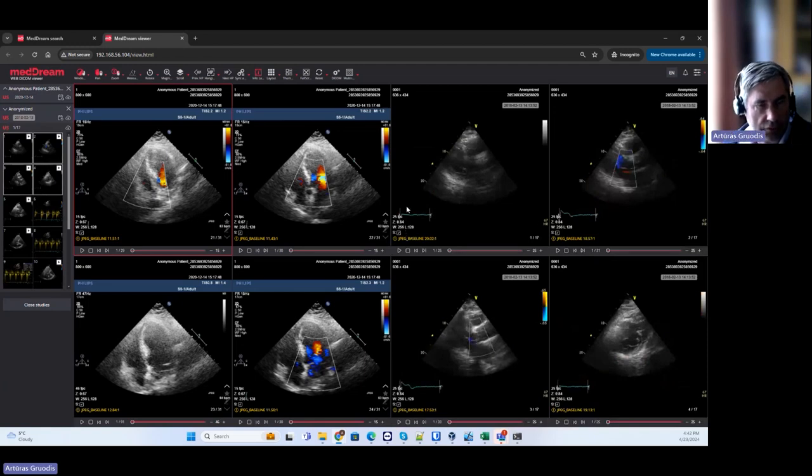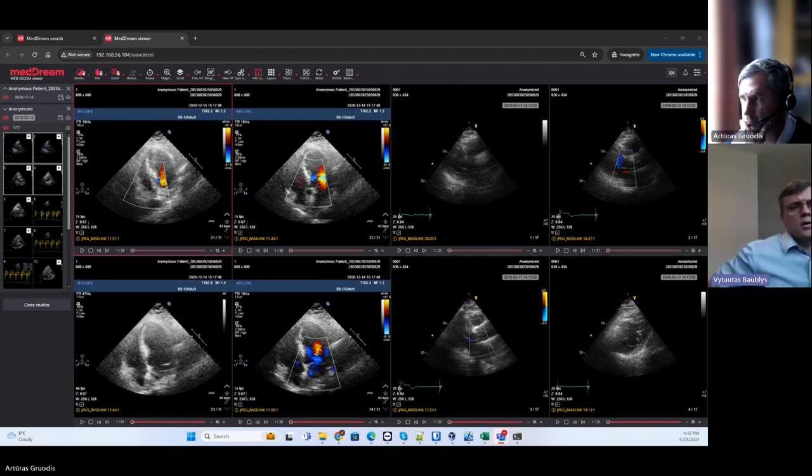Okay, so this is a very short presentation. Once we finalize them, we will make another session dedicated to hanging protocols, how to implement them, but most probably it will come after the next version. Our plan is to release the new hanging protocols version, and then we will do, like usual, some technical trainings for all our partners.